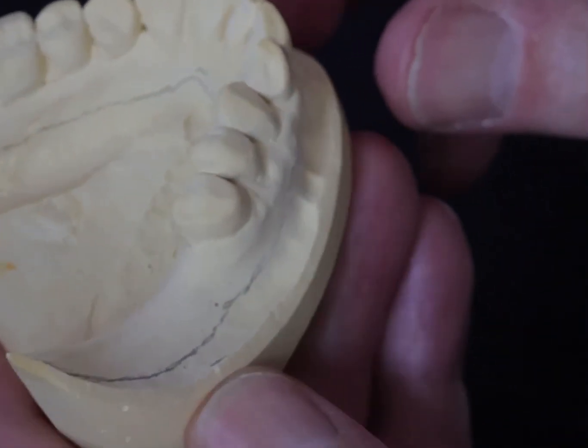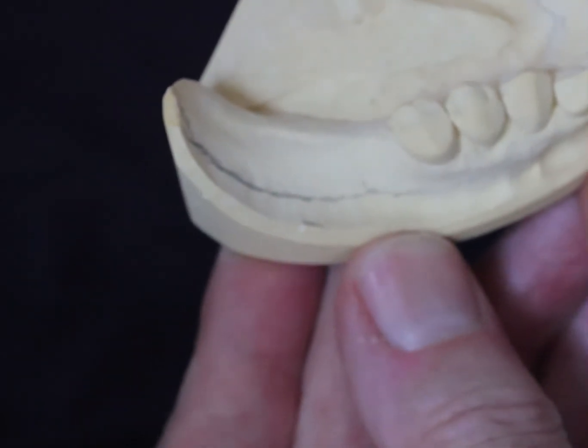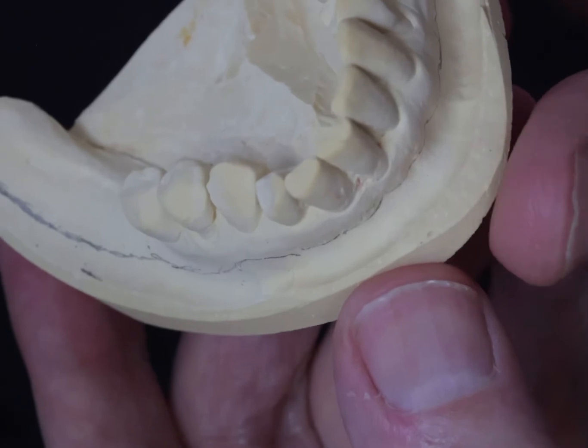So there we have it — lower tray outlined. Make sure it's short. The two-millimeter under-extension rule is not always appropriate. If your impression is significantly overextended, a tray being two millimeters short is still going to be too big. I hope that's useful.